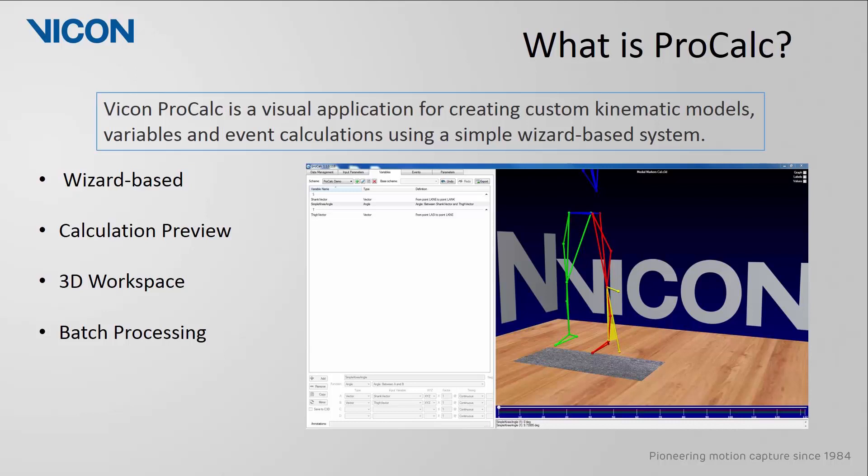In addition, as you perform these calculations, you will actually see a preview in the 3D workspace, allowing you to check to make sure that the parameters you are calculating are correct. Once you have all your calculations complete, you can apply them to all your trials using a batch processing feature.